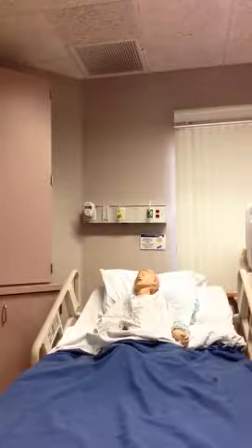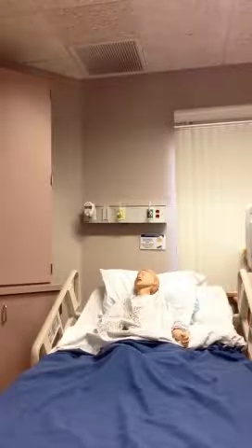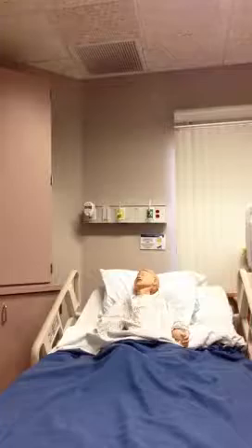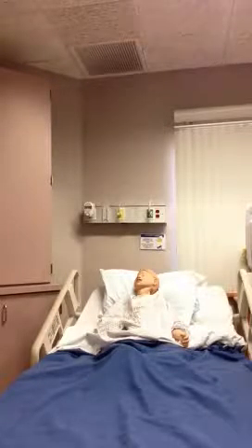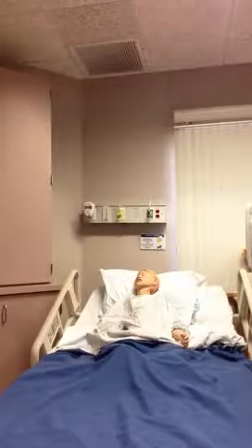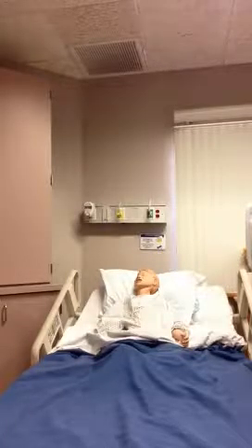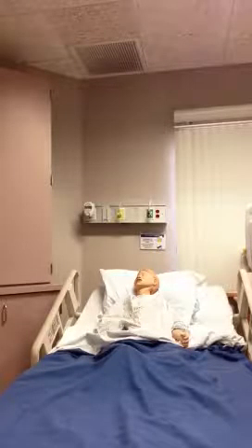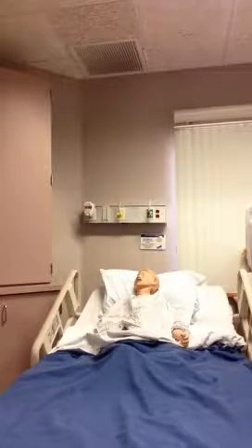As I wait for that to dry, I'll go ahead and get the test strip ready. Put that in the glucometer. Okay.